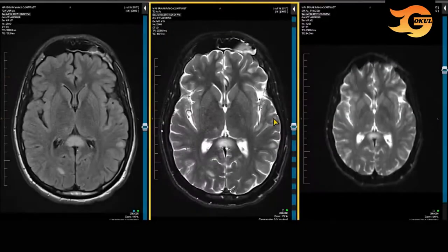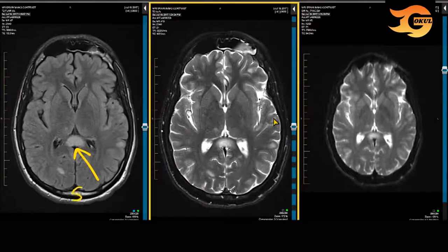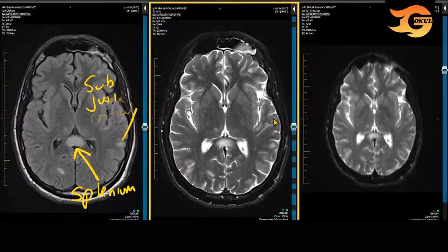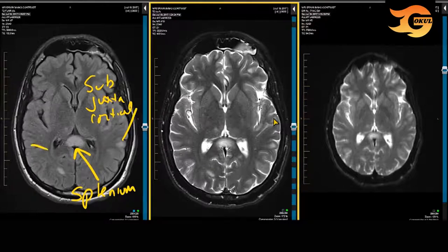We have a large area of demyelination in the splenium of the corpus callosum. We have white matter lesions that are subcortical or juxtacortical. And we have demyelination which is occurring in a periventricular region.